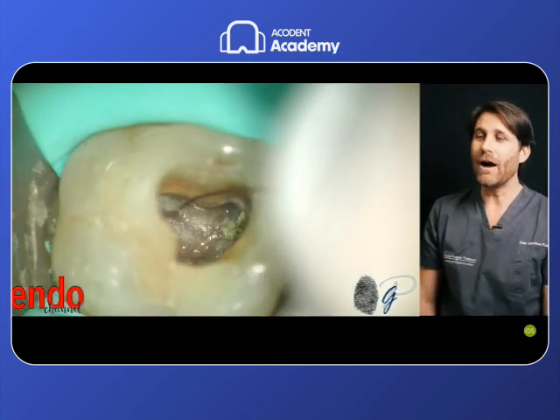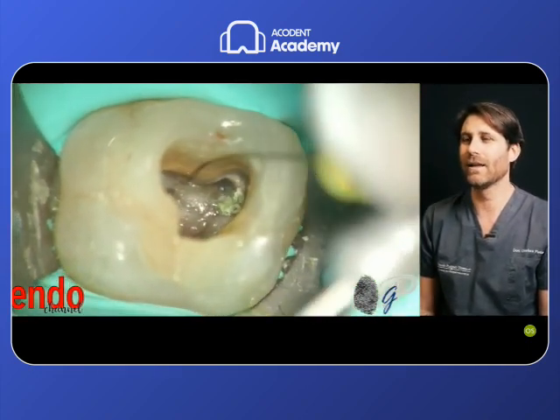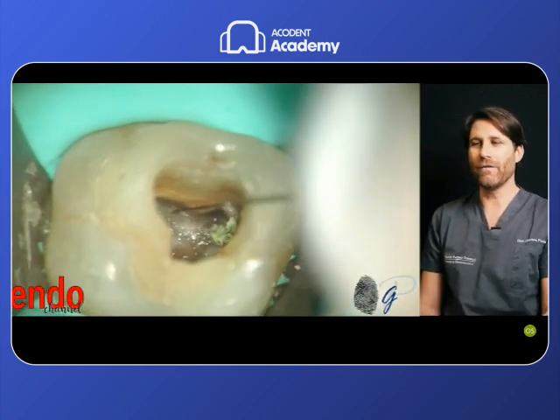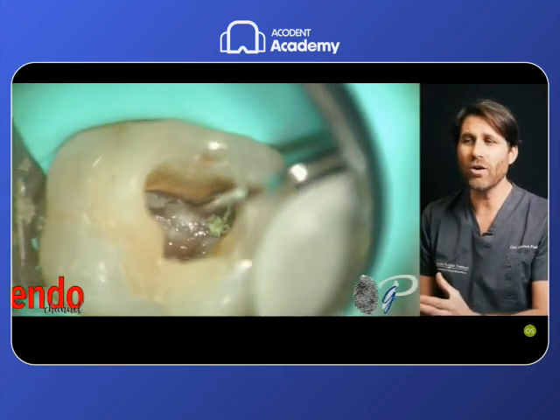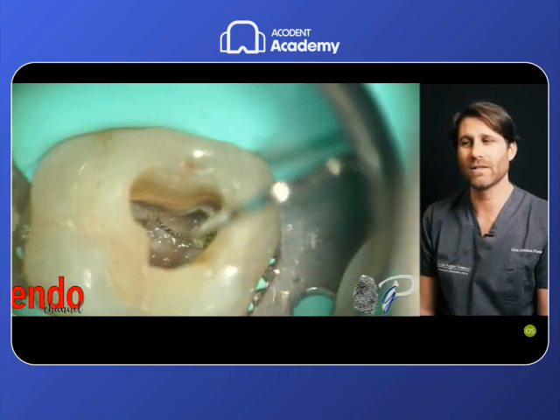In this video, after the orifice location, we tried with the manual scouting, and you can see the size 8 stainless steel K file is not even able to penetrate more than 1 or 2 millimeters into this orifice that we located. So the first strategy here can be to use ultrasonics to penetrate deeper inside this root, but I don't like it because it's more aggressive and less conservative.